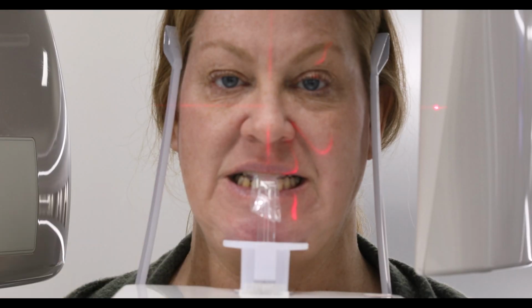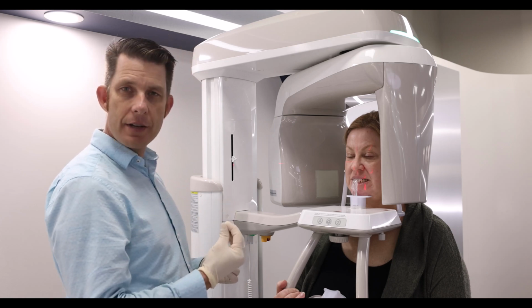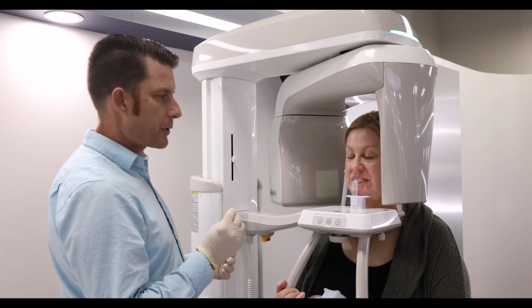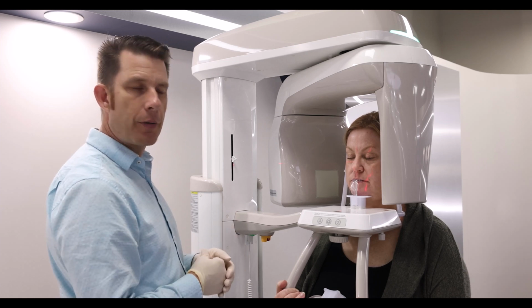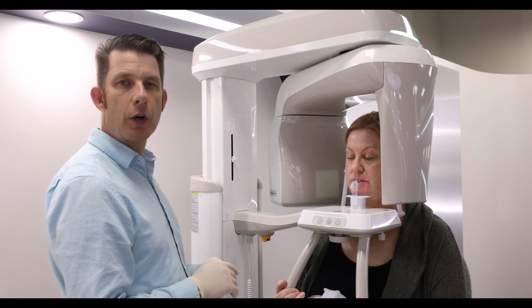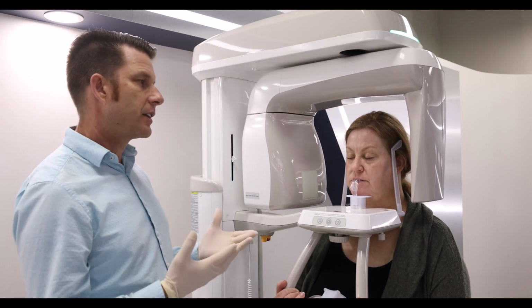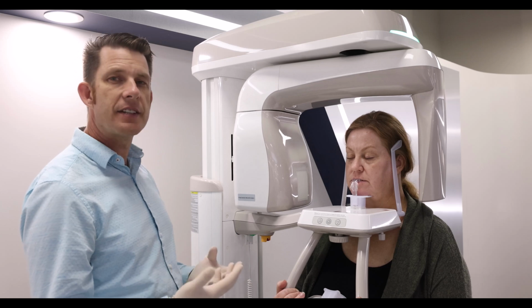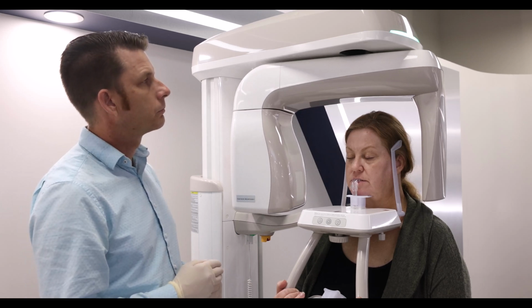Once we have our patient positioned, I'm going to go ahead and have the patient close their eyes, close your lips around the bite stick, go ahead and swallow and keep the tongue to the roof of the mouth. We're going to step out of the room and we're going to go ahead and take our image. I've selected ready on the device and the device is now initializing for image capture. Close your eyes until image capturing is complete.